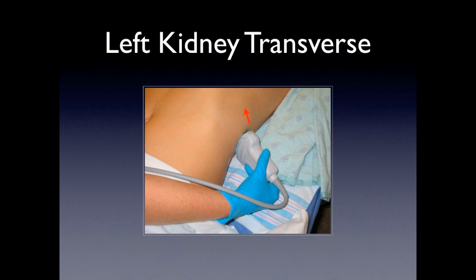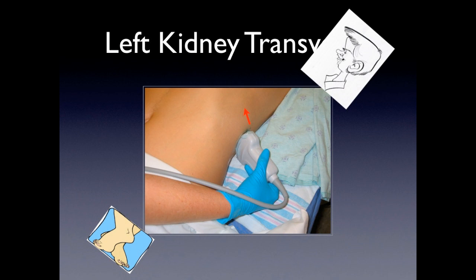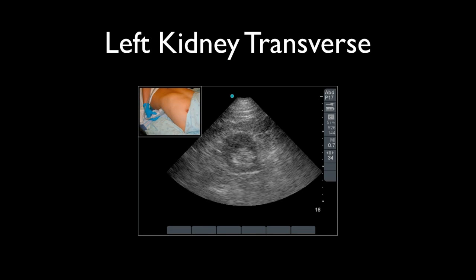For the left kidney transverse view, the indicator is going to be pointing upward. Head is on one side, feet on the other, and you should be able to visualize the structures. We'll quickly review the kidney, spine, and anatomical orientation.